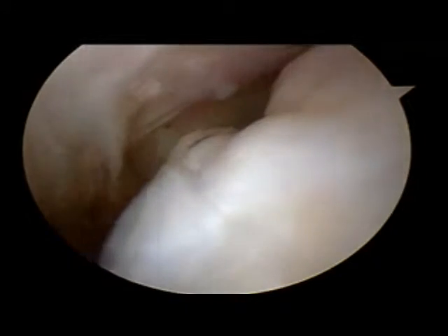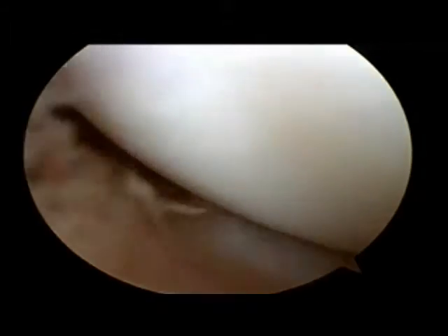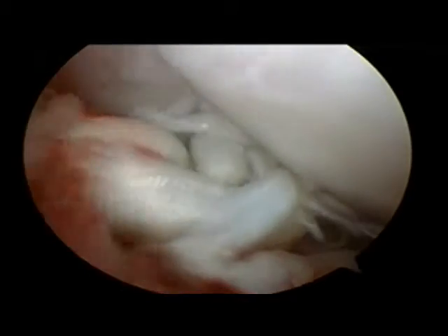This is an arthroscopic video of a canine stifle joint. What we're seeing here are large osteophytes, or bone spurs, that have formed. This particular patient has an anterior cruciate ligament tear — an ACL tear — and the bone spurs that formed were secondary to the chronic inflammation.